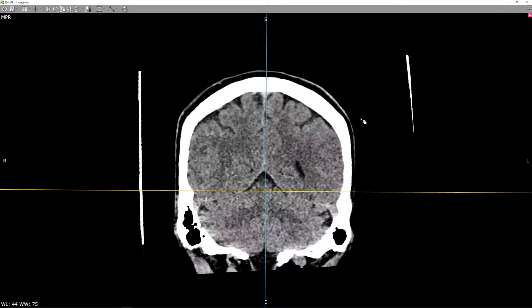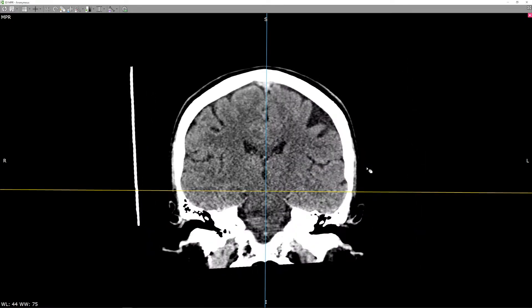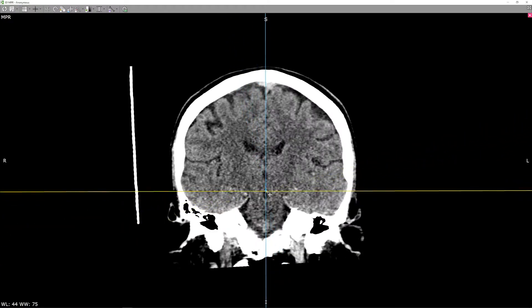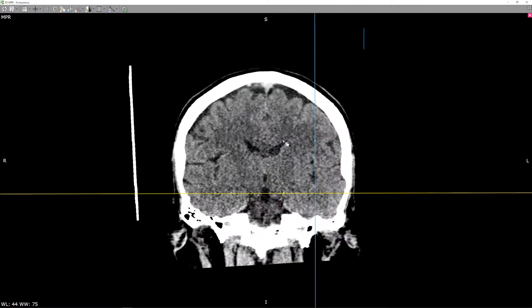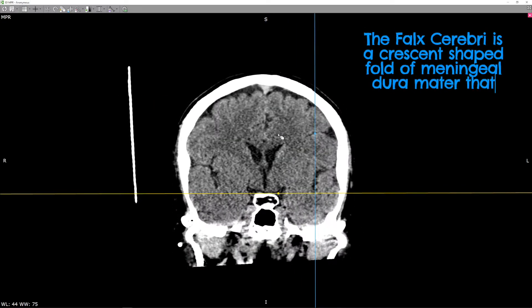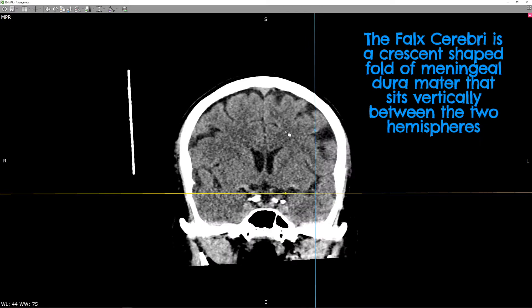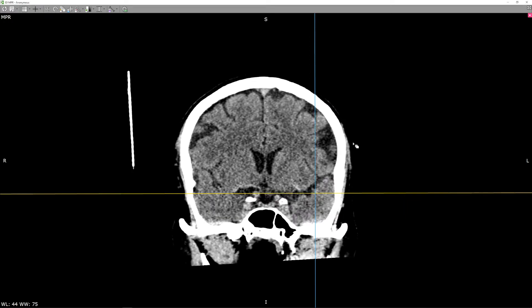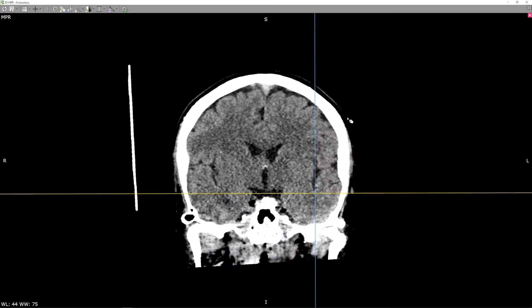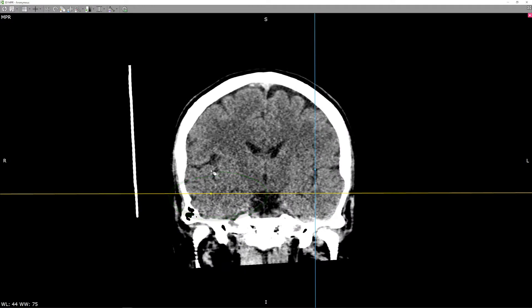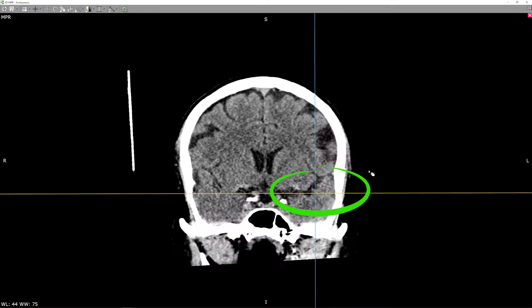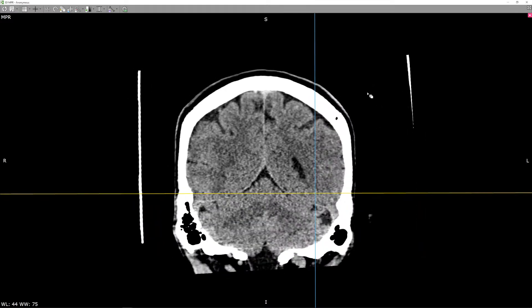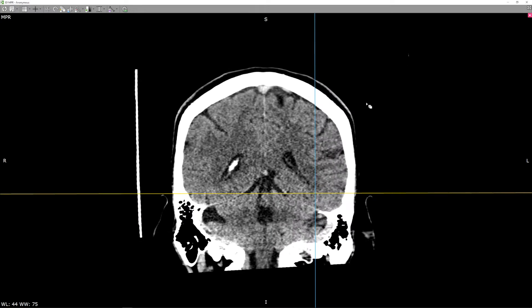In addition, it's also useful to look for collections that are adjacent to the falx, as you can see over here. Furthermore, this view is great for comparing lobes, in particular the temporal lobes shown here, to look for asymmetry in diseases such as Alzheimer's and dementia.